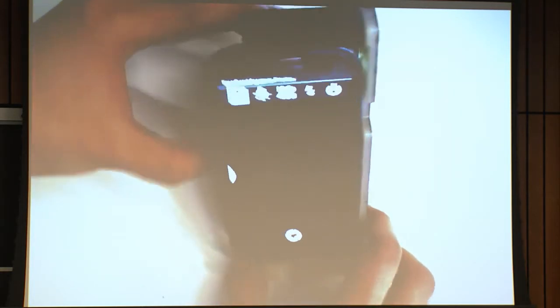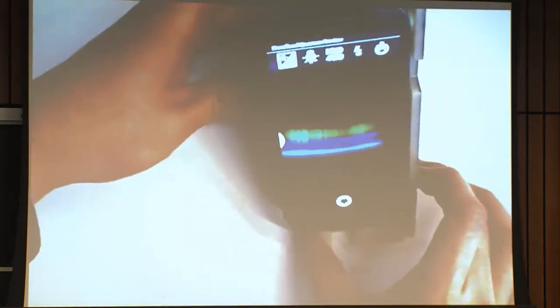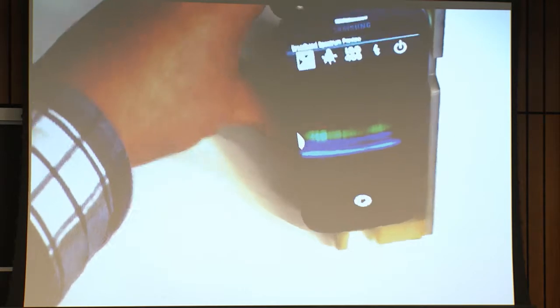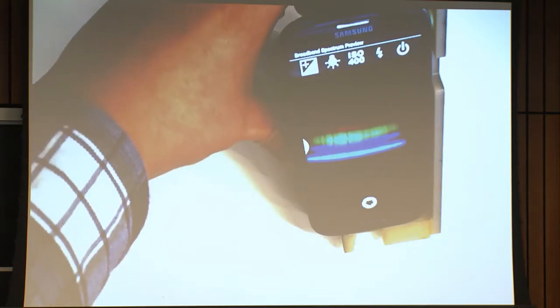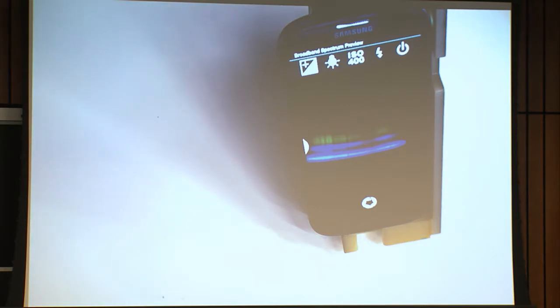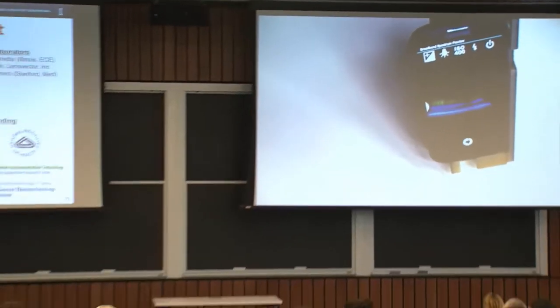Yes. Once you developed this, you said you started out with the iPhone 4. How difficult was it to adapt this, once you figured out how to do it, to different iPhones or other cell phone technologies? Was that difficult? Yeah, so the biggest problem we had with using the iPhone is that the operating system doesn't allow us to really get in and change things, even for controlling the exposure time of the camera. So that led us to change to Android phones.